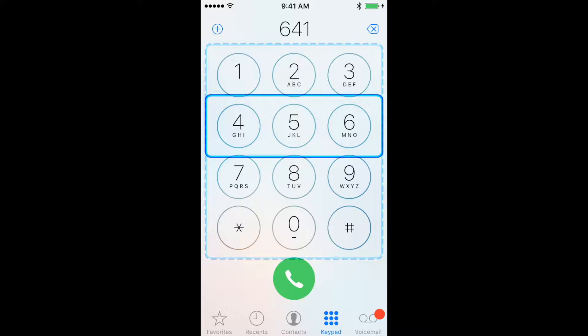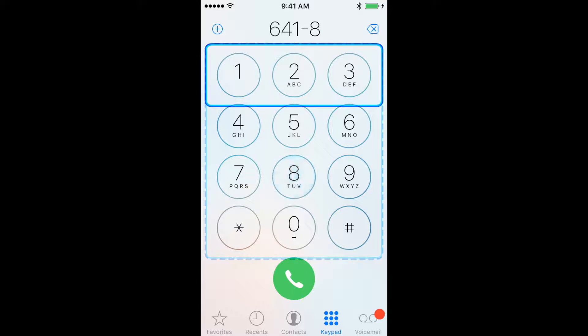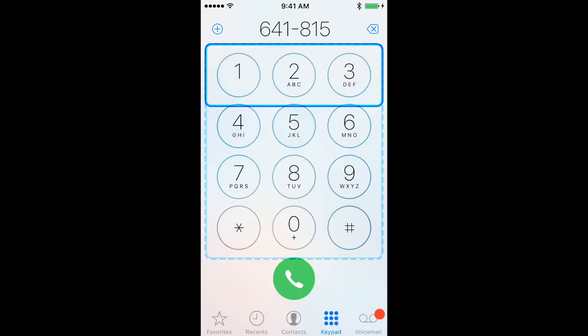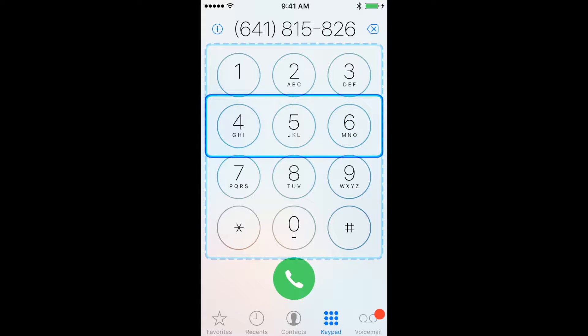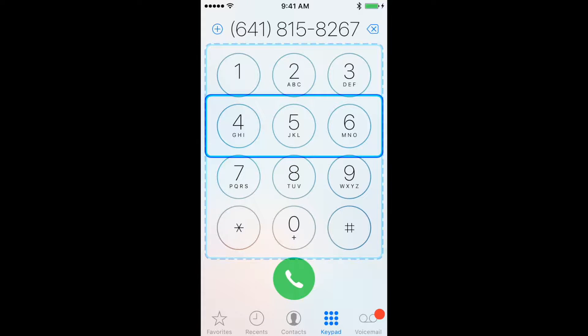Repeat this for each number. When you have entered the full phone number, wait until the keypad is highlighted with a dashed line to step out of the number keys.